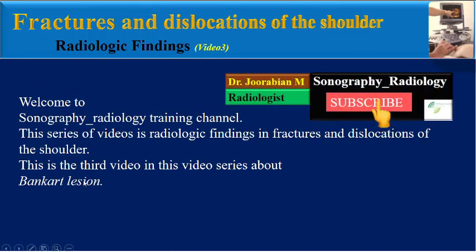This series of videos is radiologic findings in fractures and dislocations of the shoulder. This is the third video in this video series about Bankart lesion.